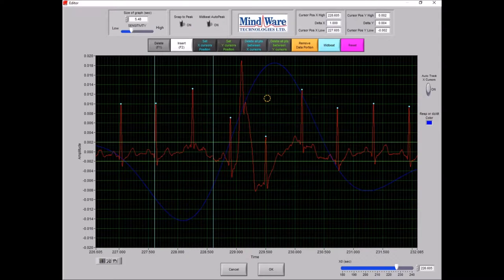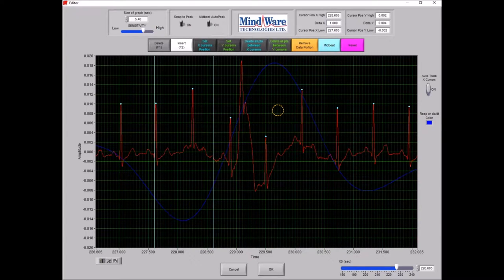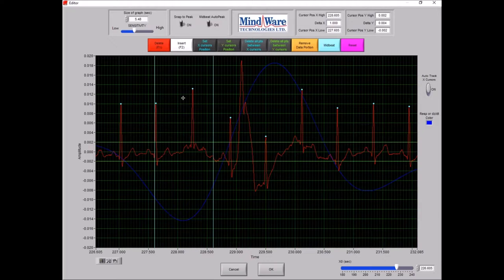The circle can be expanded or contracted using the mouse wheel — pushing forward increases the diameter, pulling back decreases it. There's also a sensitivity meter in the upper left corner that adjusts accordingly. If you don't have a scroll wheel, you can use that sensitivity control to perform the same action. When I'm done deleting, I'll turn off the delete tool by pressing the delete button again.